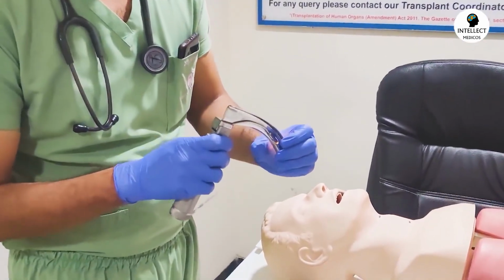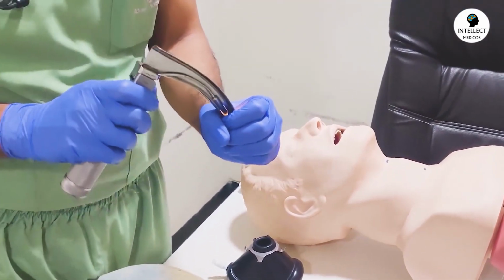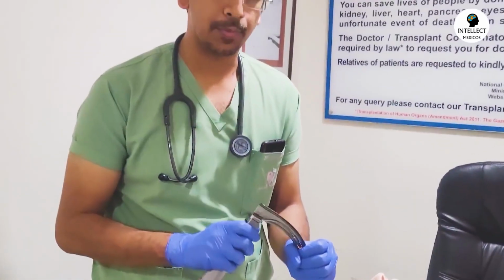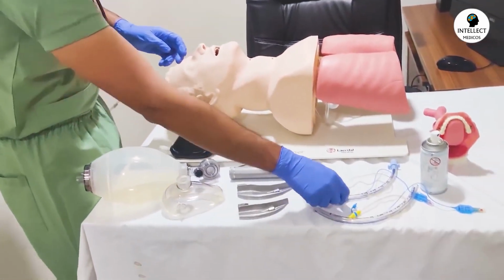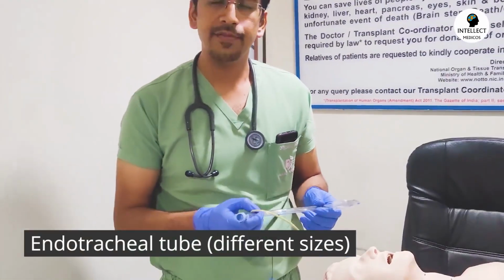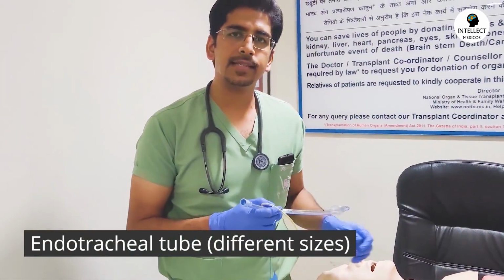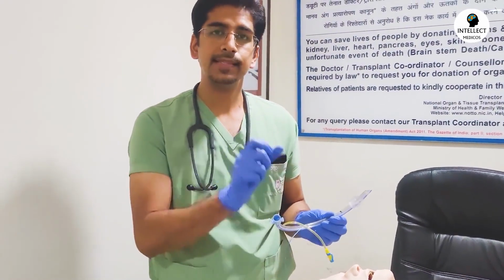Now if you are able to see the creases of your hand with this light, that means this is appropriate. The light is appropriate. Now coming on to the next thing, which is very important. This is the endotracheal tube, which we are going to insert inside the trachea of a patient. Endo means inside and tracheal means it is going inside the trachea.